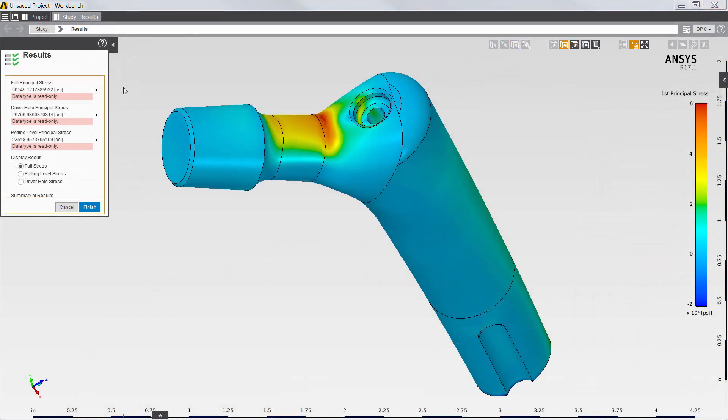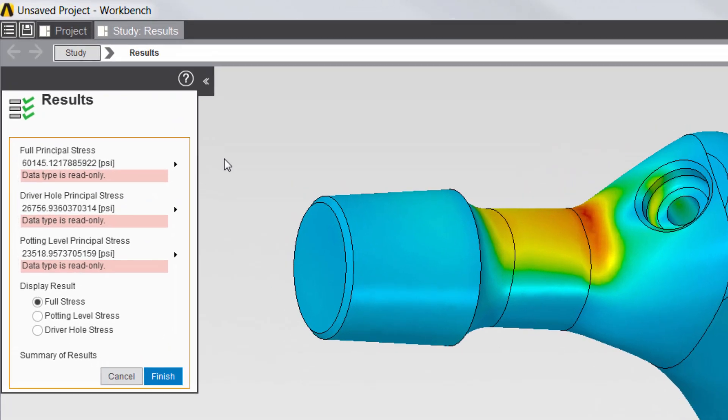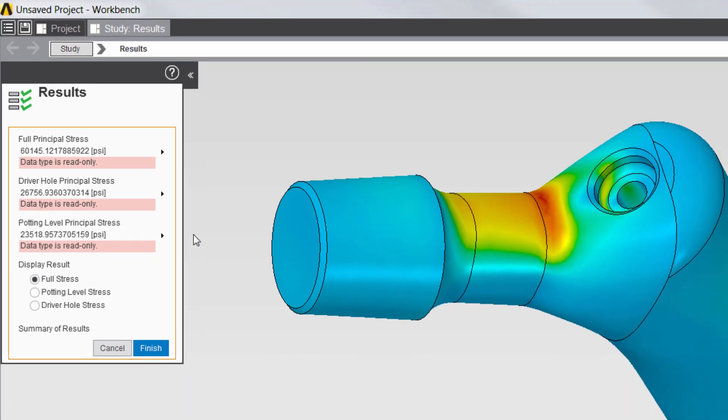Once the solution is complete, I can review the results created by the app. Principal stress results are reported for the full model, the driver hole, and potting level locations.